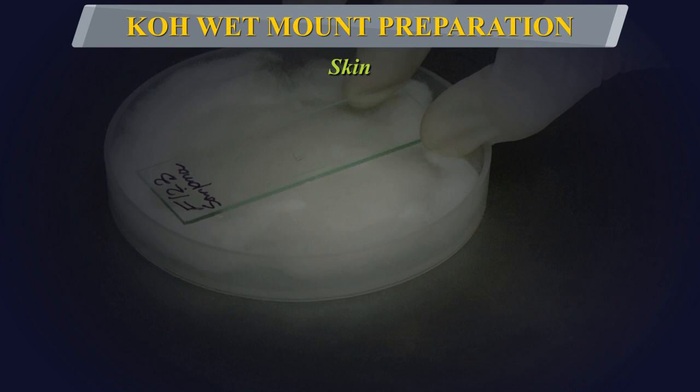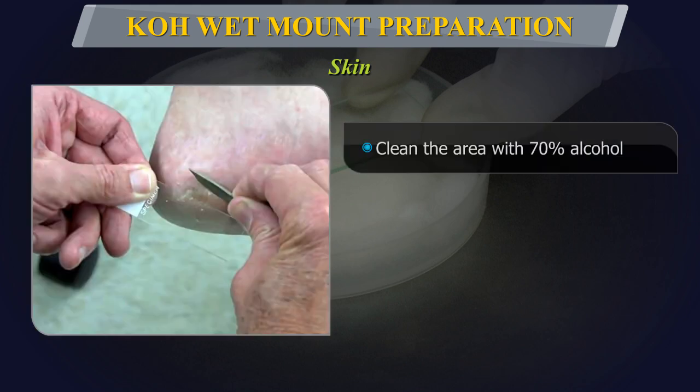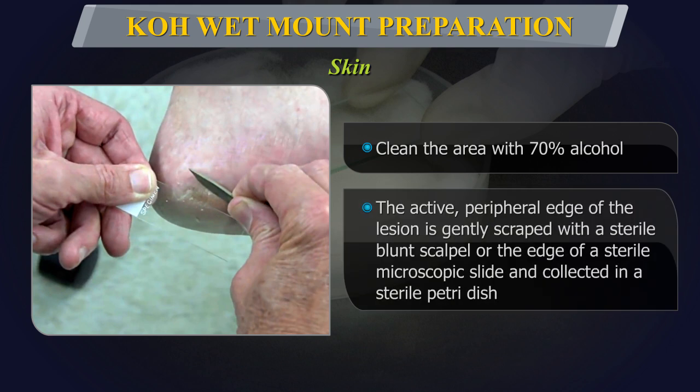Skin: Clean the area from where the skin specimen is to be taken with 70% alcohol. The active peripheral edge of the lesion is gently scraped with a sterile blunt scalpel or the edge of a sterile microscopic slide and collected in a sterile petri dish. The sample can also be collected directly onto a sterile microscopic slide.